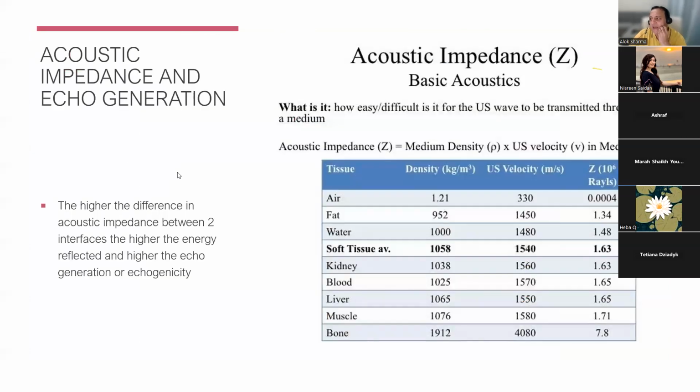As we will see, this is just a slide which shows you the different kind of densities, and it's quite interesting. If you look at bone, it's nearly 2000. If you look at fat, it's much lower. Water, again, fluid, much lower. But from our perspective, again, air is a massive reflector. What you're looking at is the difference between acoustic impedance.